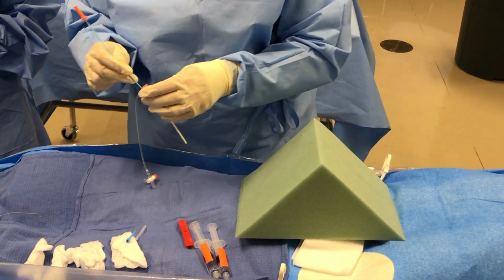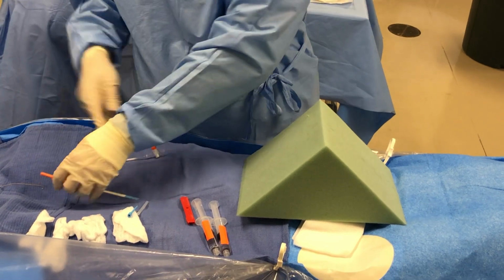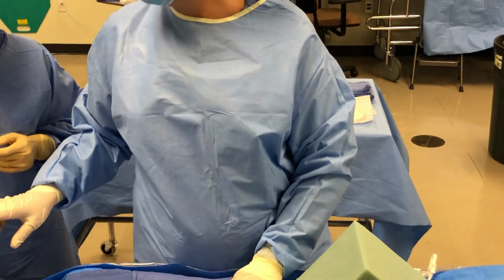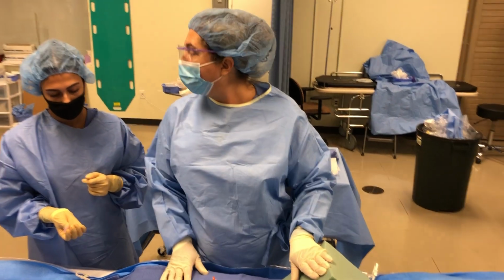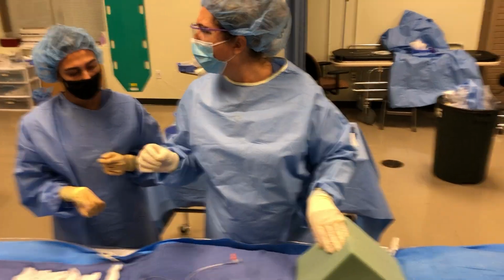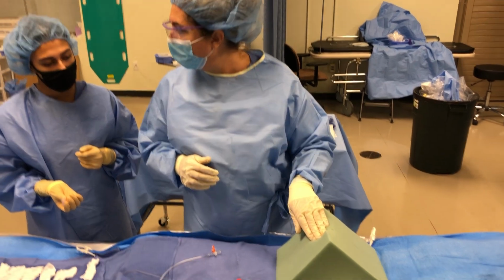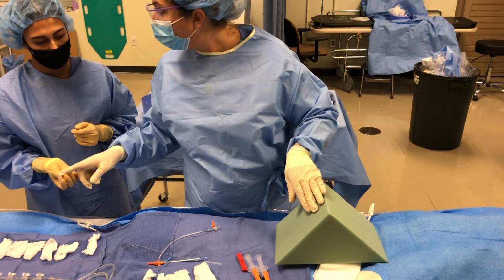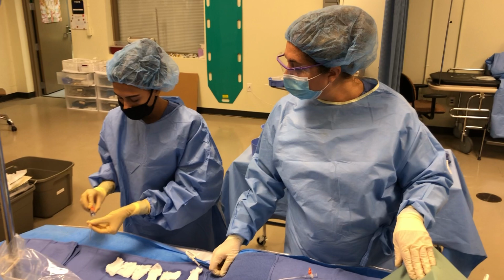Go ahead and get that arterial needle back for me. We're going to use the long wire, good. Now, just say, this is a good place to do this, if the doctor had tried to get in, and then something happened, they weren't getting good access, they ended up pulling everything out, holding some pressure, you've already used this needle, or now we're going to access the vein. You need to flush that needle. So you'll get your flush.